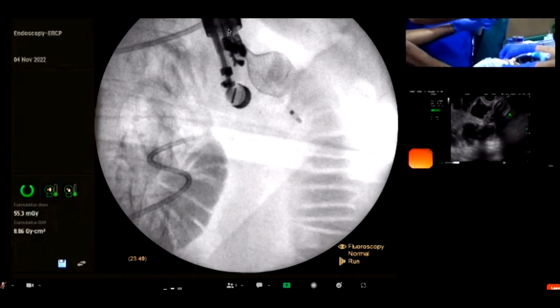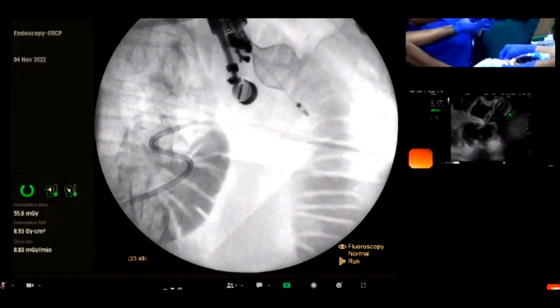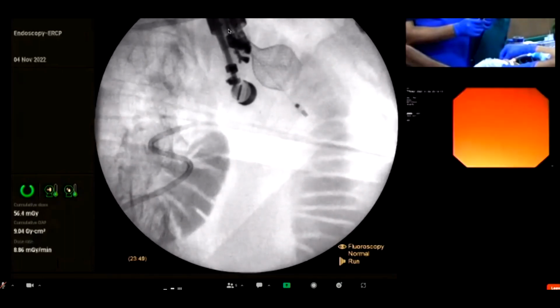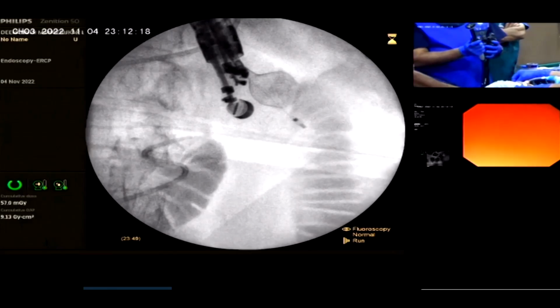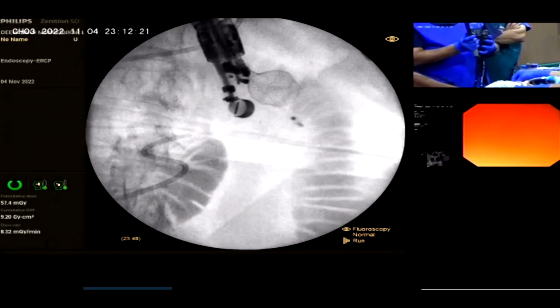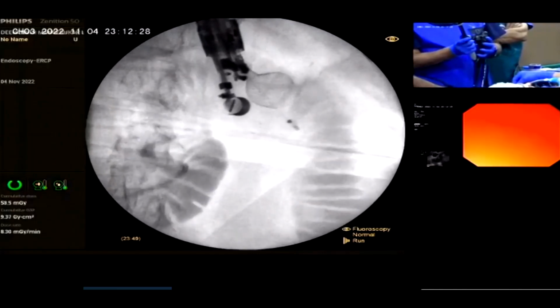And now I will release the next flange, and I am going to release that inside the scope. I have released this inside the scope. Now I will open up the EUS, the endoscopy image, and now let us look, see what we've done. Elevator open. I give a little bit of air, big wheel down, and I start pushing the stent out a little bit at one time.